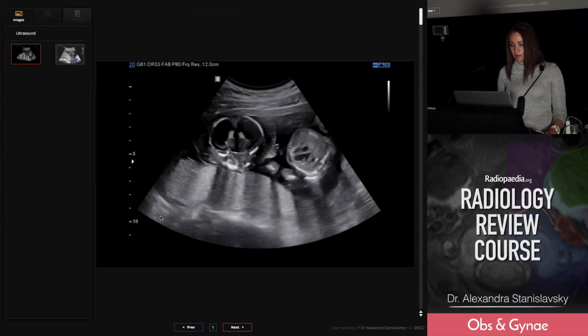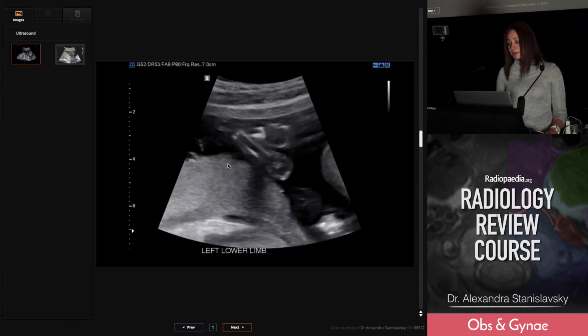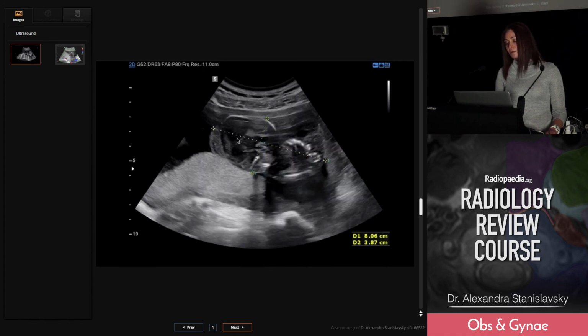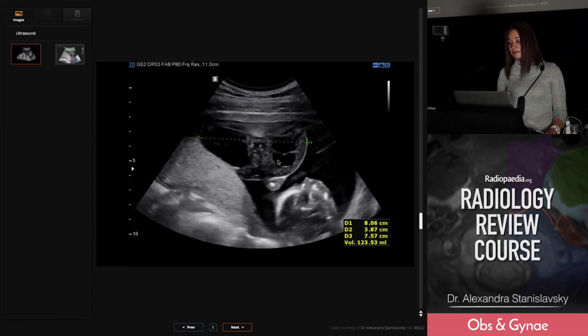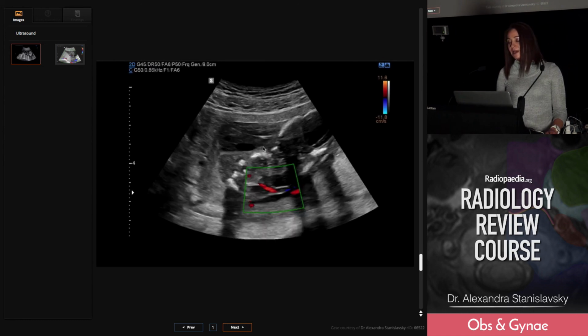So this is a case of monochorionic babies. This is a well twin. This you can see is an extremely hydropic twin. This is the normal baby, normal baby, normal baby, normal baby, abnormal baby. So head, hydropic, abnormal mass without really well-defined fetal parts. Superficial vascular anastomosis through the placenta. And this is the key image, and it's kind of tricky, but this is very helpful. This is actually the cord going to the abnormal twin, and you can see that it flows in this direction. So this is an abnormal direction for flow in an umbilical artery, right?